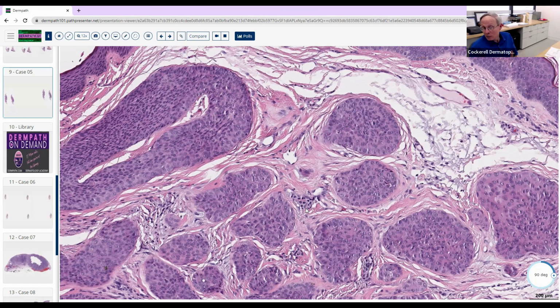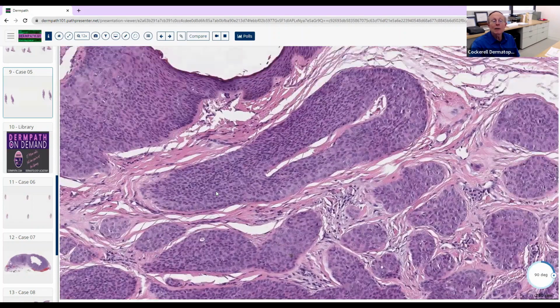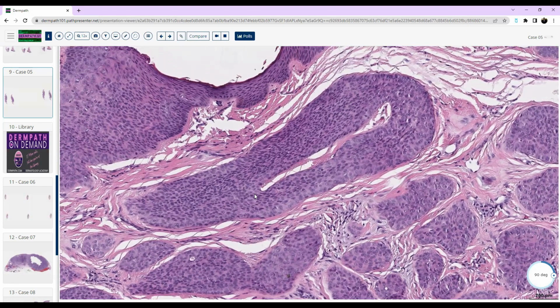Okay, now with the epithelial, they say, what kind of epithelium, right? We just talked about epithelioid, where things are mimicking an epithelium. Now we're talking about real live epithelium. So we have maybe 4 or 5 types of epithelium that normally live in the skin. What do we think of when we think of epithelial? We can think of follicular differentiation, ductal differentiation. When we think of ductal, what type of epithelium has ducts associated with it in the skin?